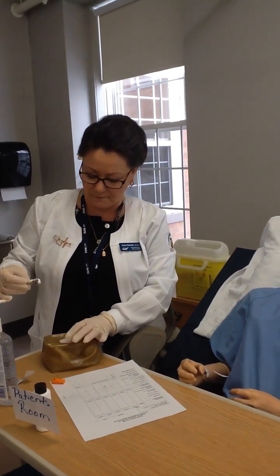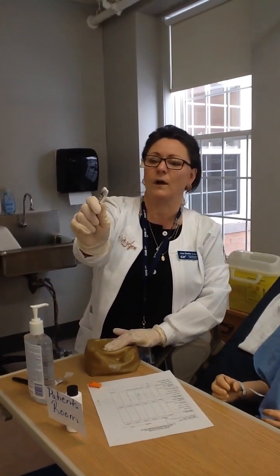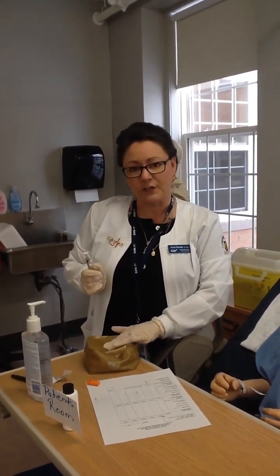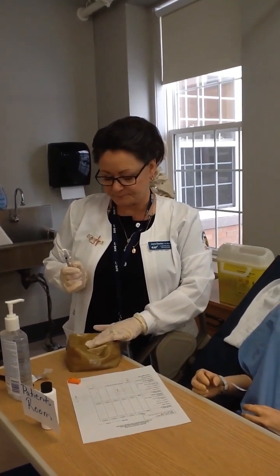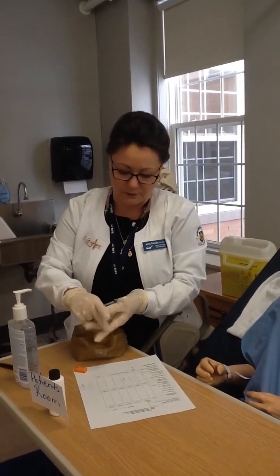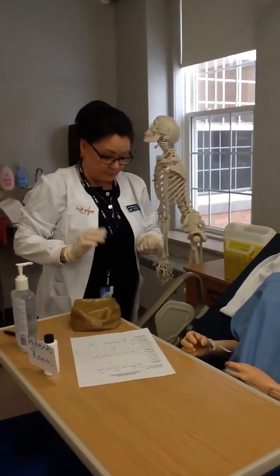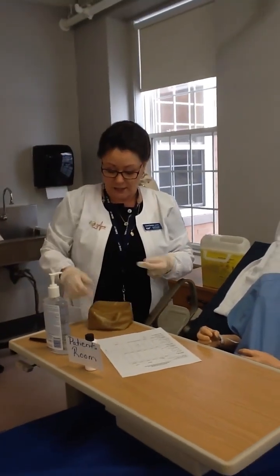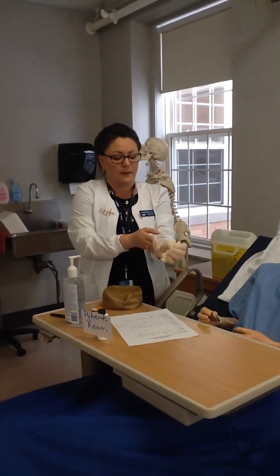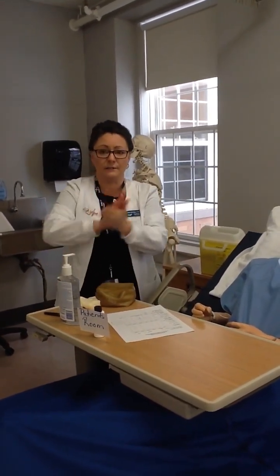Let the swab fall right down on the injection site. Lock our needle with our thumb. That's a one-handed motion. That's a safety lock. Apply gentle pressure for 10 seconds. It's all good. We can put our needle in the sharps container. And we can put our garbage in the garbage. I'm going to remove my gloves. And I'm going to perform hand hygiene.